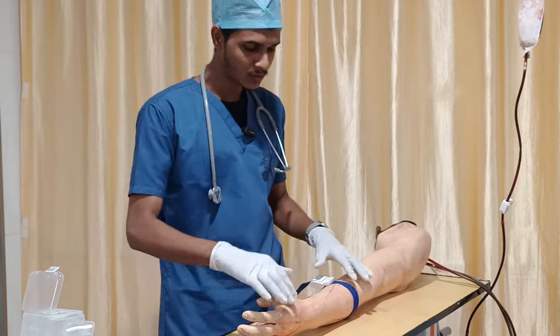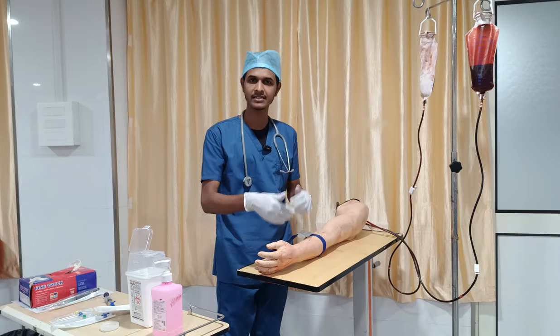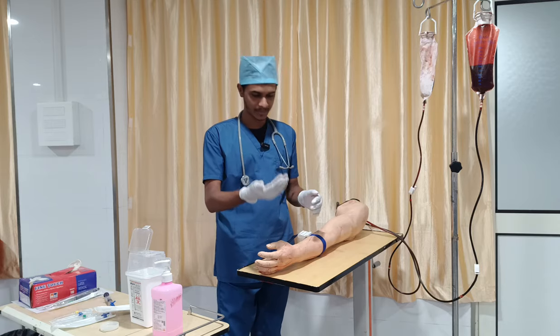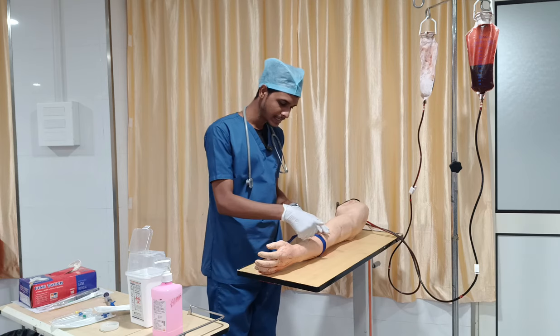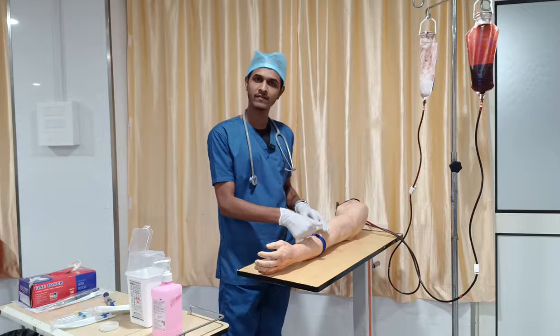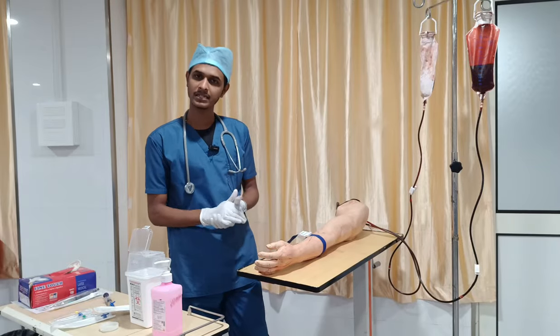Or else, you can hang the hand like that. You can place the limb below the heart level. Because of gravity, there might be a chance of engorging or bulging of the vein. Or in the third step, you can gently tap over that region, or gently strike over that vein. Thereby also we will get engorging or bulging of the vein.